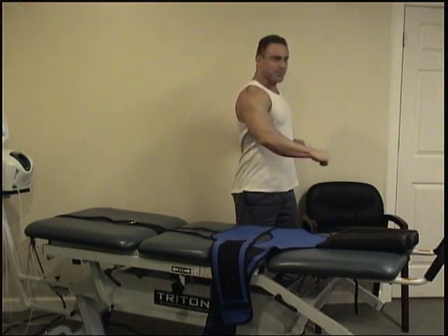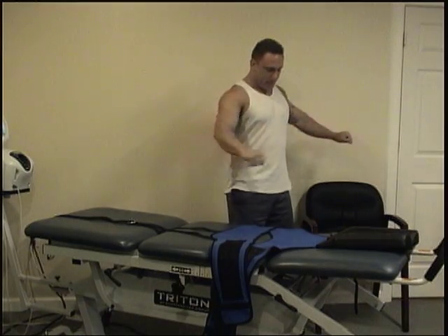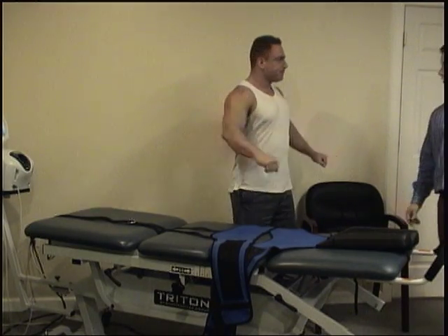I feel it. It feels much better and lighter. I feel more mobility.